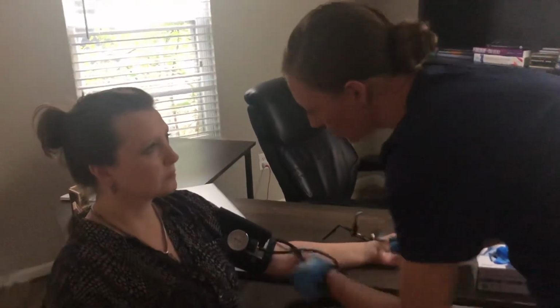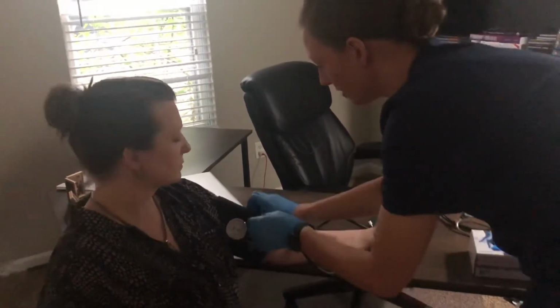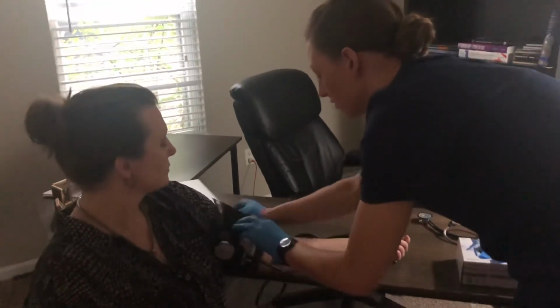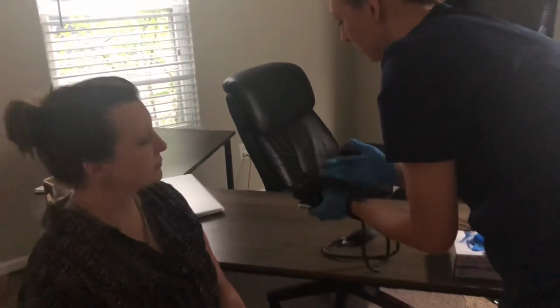Okay, your blood pressure was 118/76. So you are in a good range. Thank you very much, Renee.